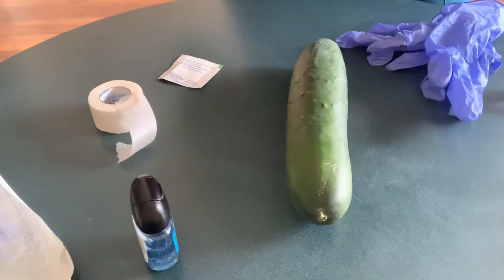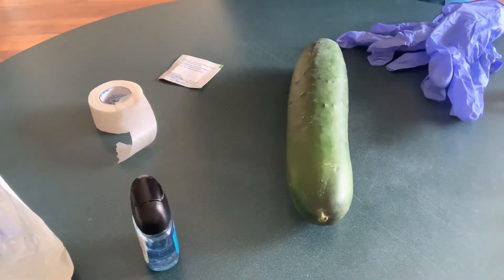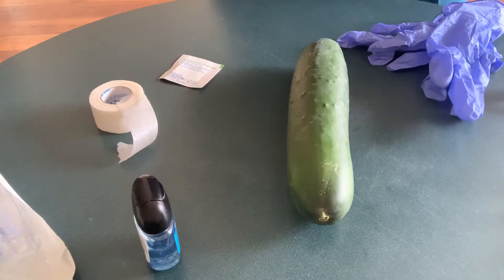Hi everyone, today I'm going to be demonstrating how to collect a blood sample using a butterfly needle stick.